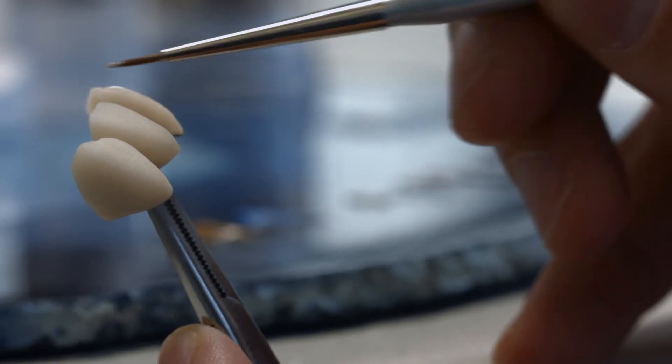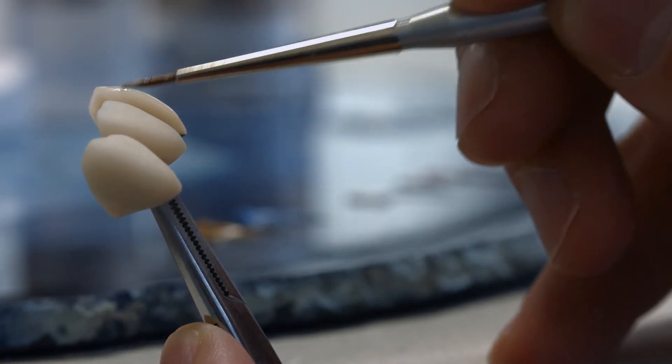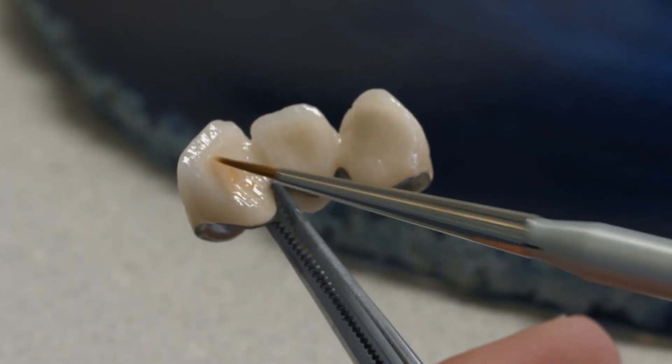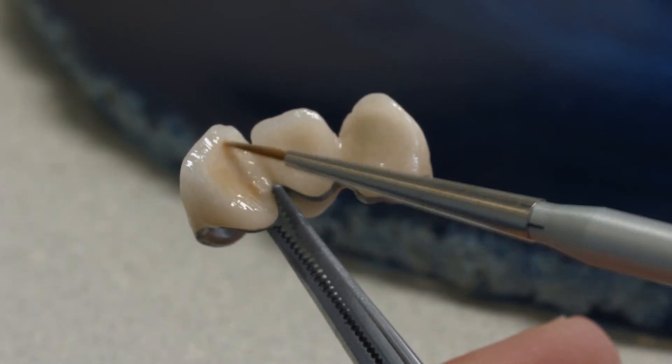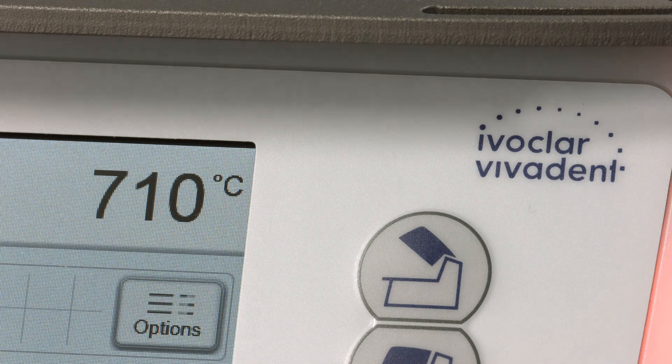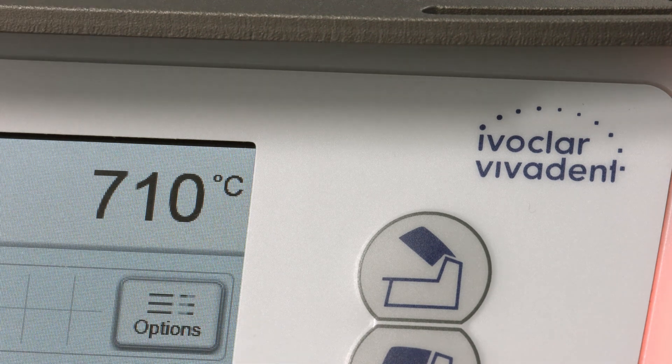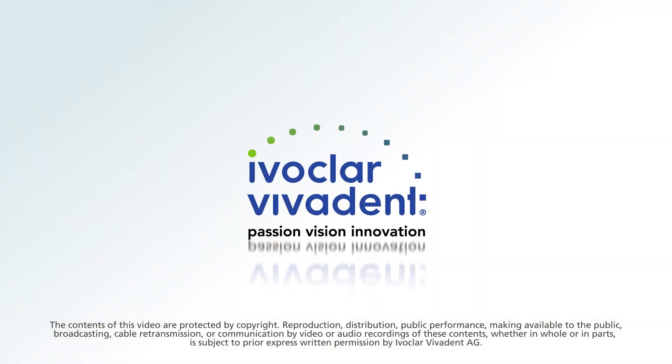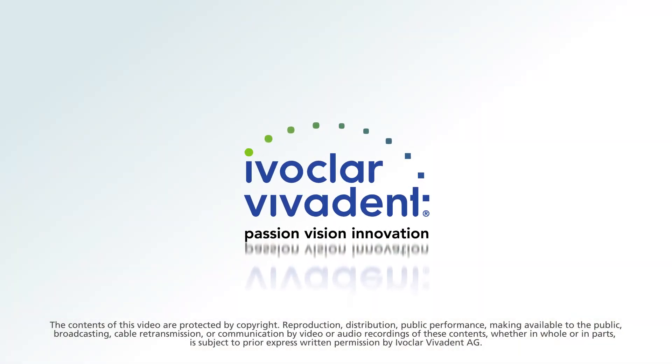Use a brush to apply the glaze on the entire veneering surface. If needed, shade adjustments can be made on the applied glaze. Observe the given firing parameters to fire the glaze.